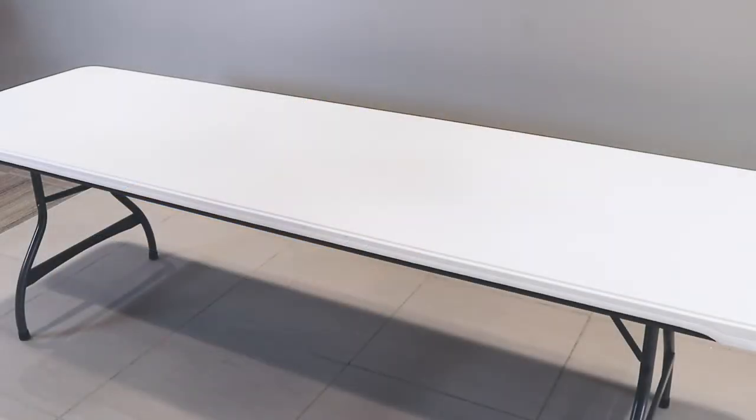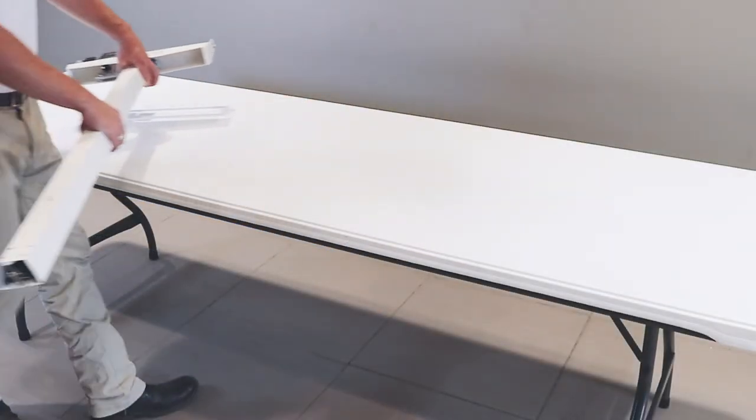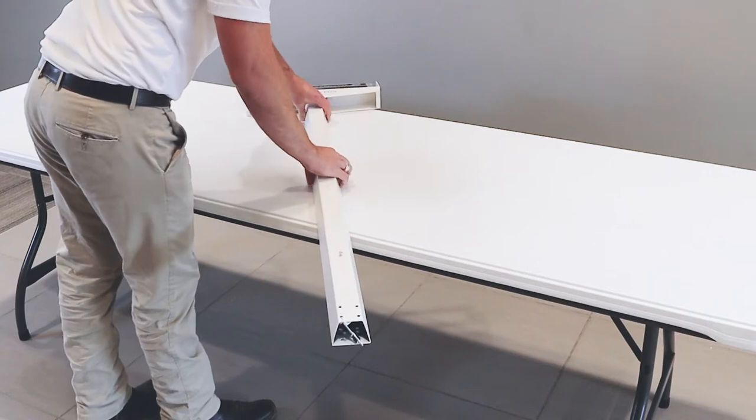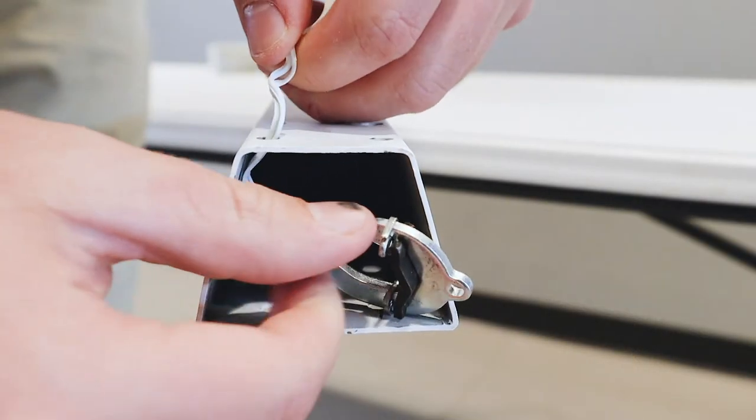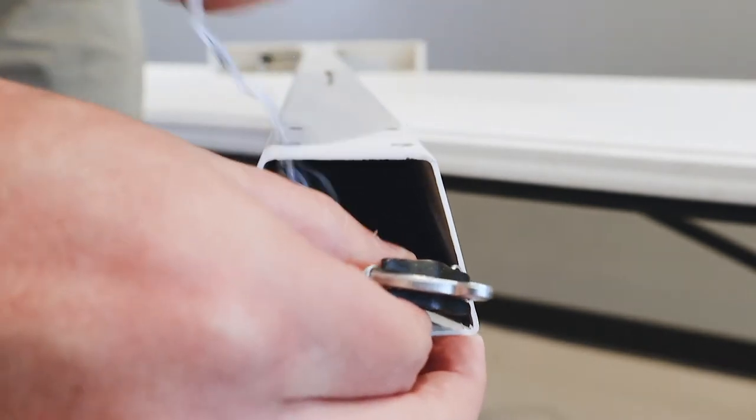After unpacking, set aside your packing materials and start with the column. Set the column on a table or workbench and on the open end, remove the cable tie securing the draft rod during shipment.